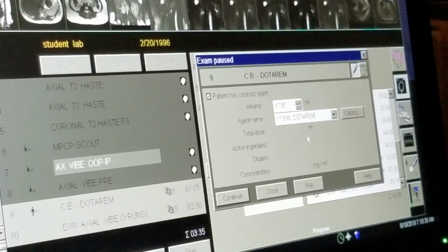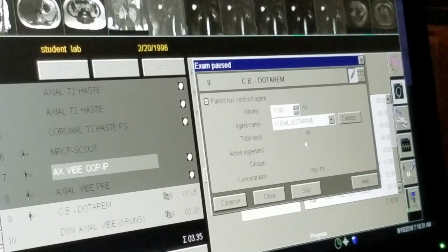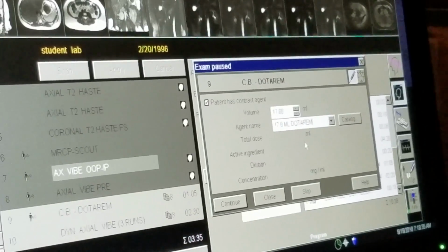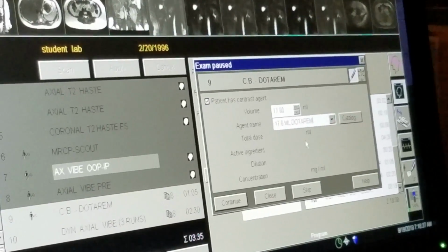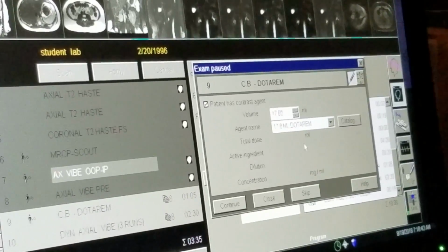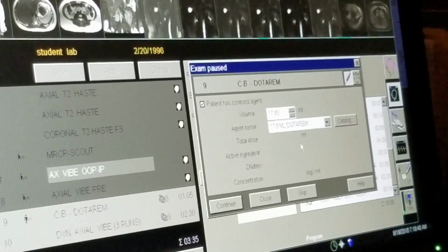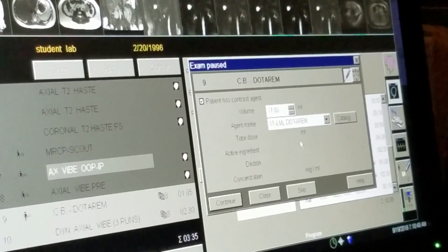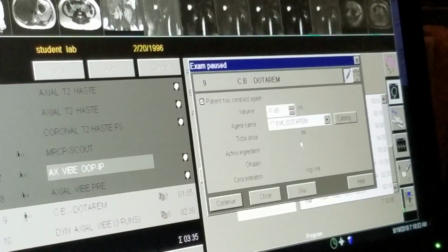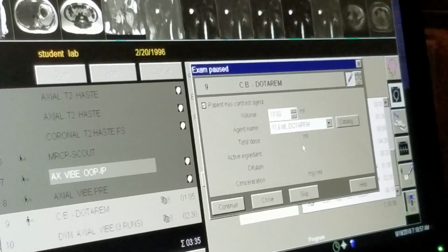And then, after quite a few seconds, over the noise of the scanner, that's when I'll tell you to take a breath in and hold it. You should be able to hear me pretty clearly over the noise through the headphones, but if for some reason I sound a little muffled or you can't quite make out what I'm saying to you, the only words I'll be saying to you over the noise is take a breath in and hold it, okay? Any questions? Very good.